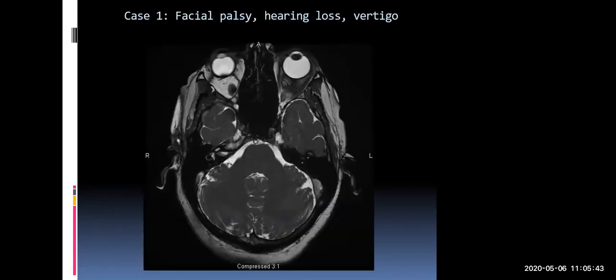In general, the caveat here is that imaging for dizzy patients is rarely indicated. It is very unusual for me personally to order an imaging study for dizzy patients. So what you're seeing are advanced, rare cases where patients present with vertigo that, because it's accompanied by facial paralysis or hearing loss, an imaging study is indicated.